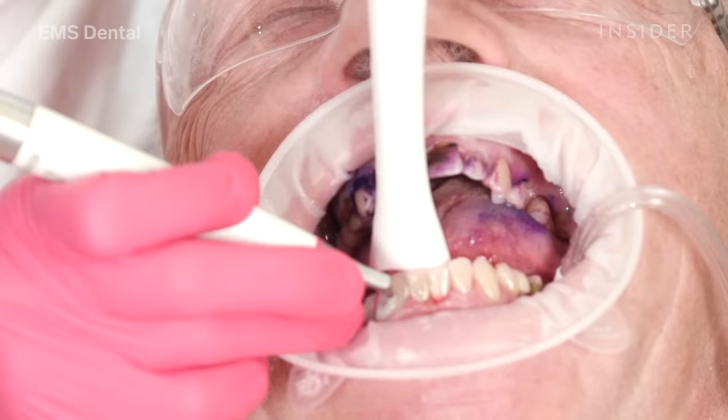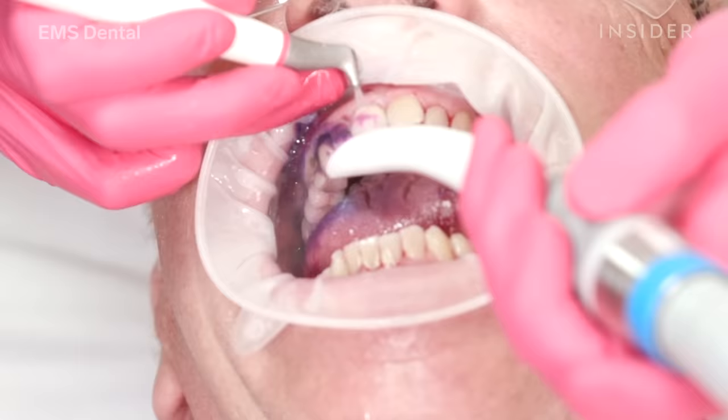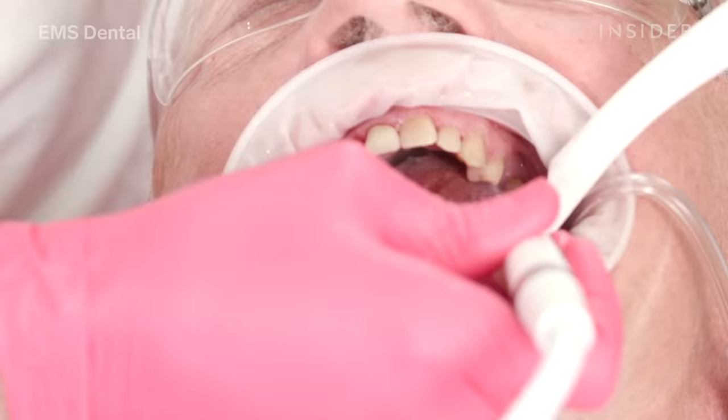It's very comfortable for the patient — it's gentle, it's efficient, and it's very safe with no abrasion or damage to the tooth surface at all.